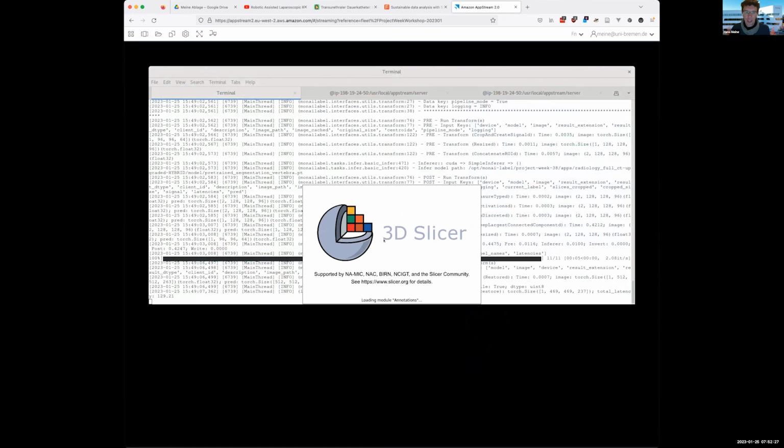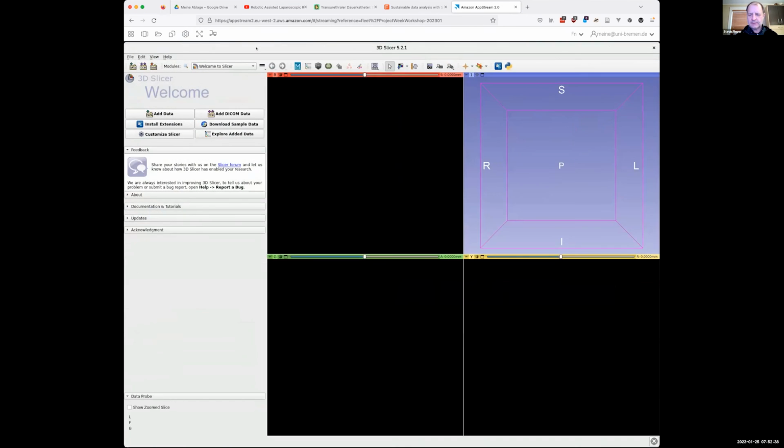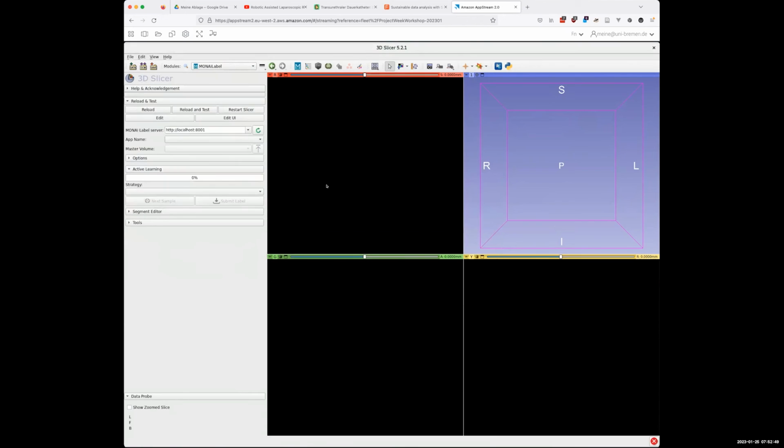I think I had the same learning back then. But for some people, it was already in developer mode, I remember. I think it depended on the region or so. Would it make sense to move those settings into an advanced section, but not require developer mode? Because I see on these demos, it always comes up that you need to enable developer mode. It might be just an advanced settings section to hide it. Now you have the options, but I agree. Good point. Something like advanced settings.